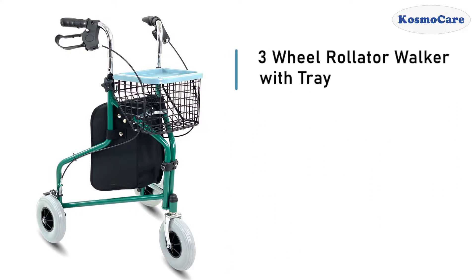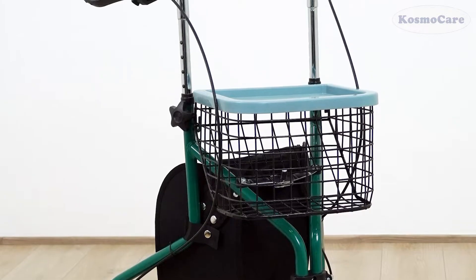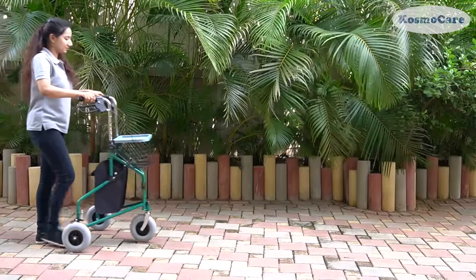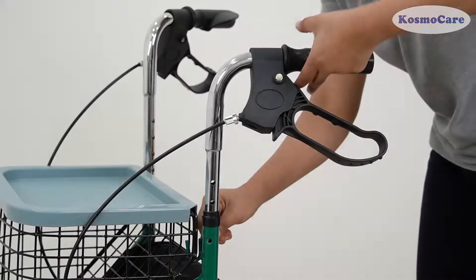CosmoCare Tri-Veal Rollator Walker with Tray provides ultimate stability during your outdoor walks. They are particularly useful in public places, such as shopping centers, parks, society compounds, etc.